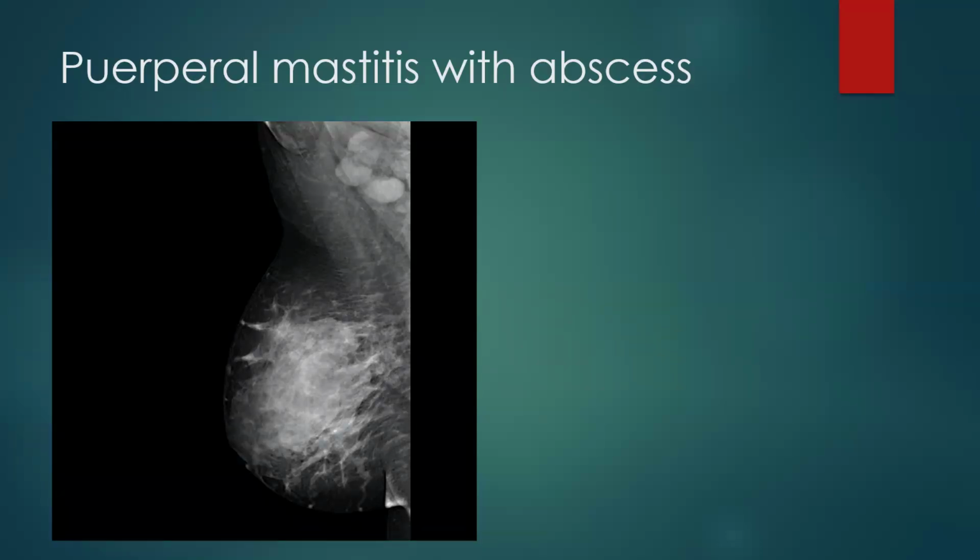This is a mammogram of the right breast. The right breast is heterogeneously dense, which could obscure small abscesses if found. In the upper outer quadrant of the right breast, there is a big oval mass with obscured margins and density equal to that of the fibroglandular tissue of the breast.